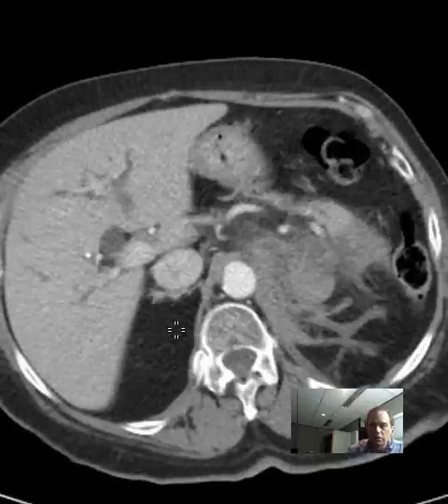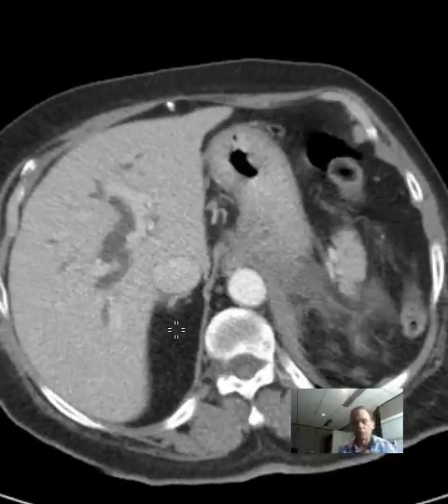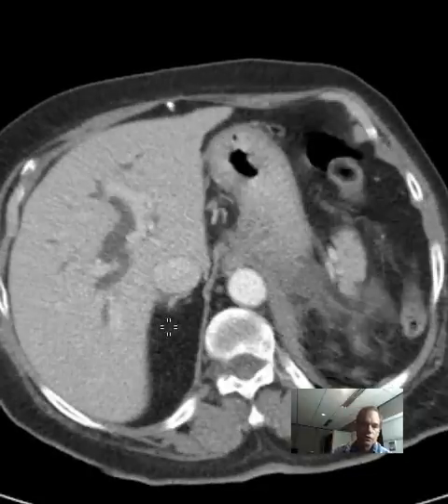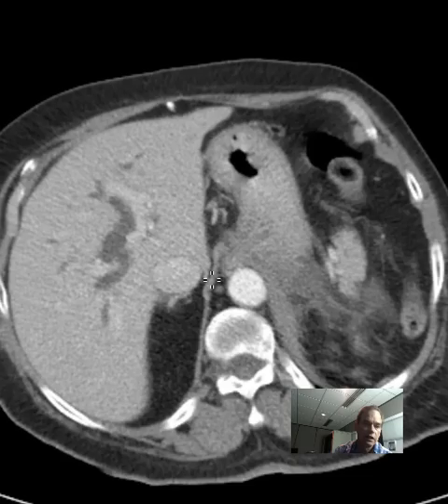Now normally there's not a whole lot to see, and that's why if you want to pick up an adrenal abnormality, you always have to look for it. The liver, spleen, a lot of these things, the aorta, all jump out at you, but for the adrenal you have to think, don't forget the adrenals. That's what one of my professors taught me, Javier Casillas from Mexico. Don't forget the adrenal gland. So there's a nice normal looking adrenal gland with two very thin limbs.